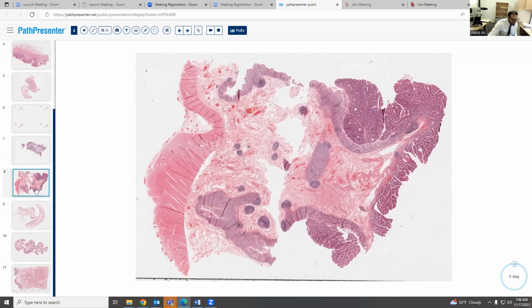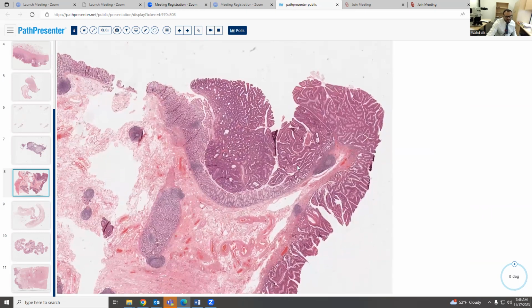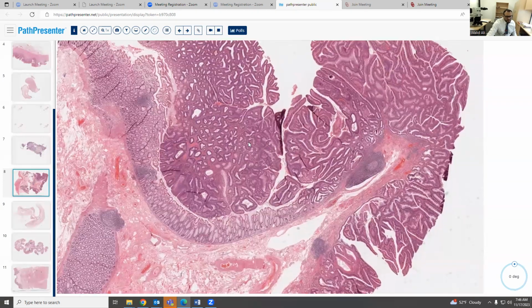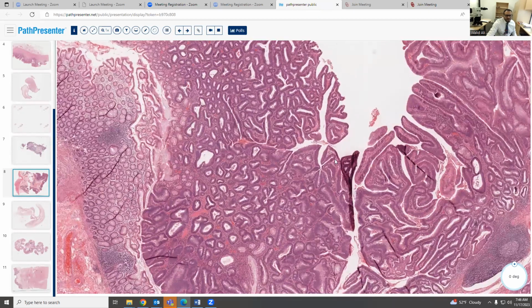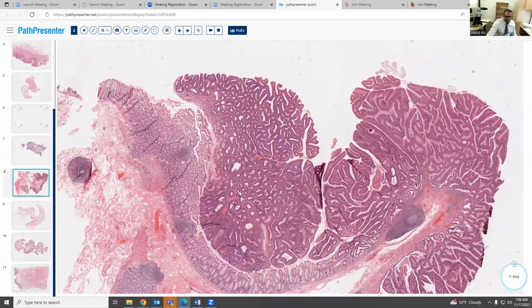This one now, I think it's an easy case, like a bread-and-butter case. I'm sure anyone here who has been to pathology will be able to know this. Here at low power, there are dark blue glands. It doesn't look like normal glands. This is a polyp, and they took the polyp out.